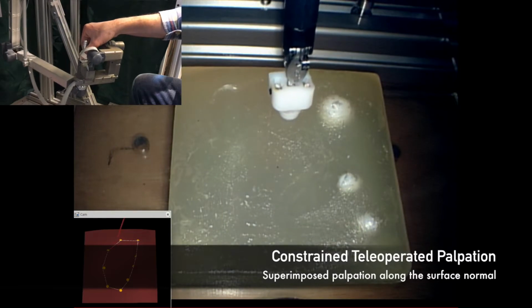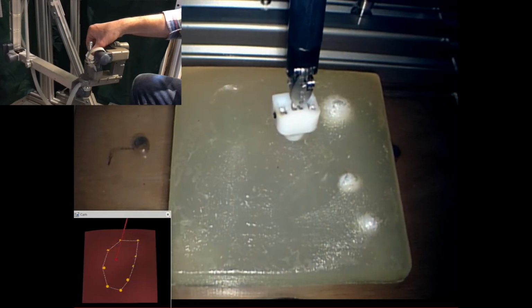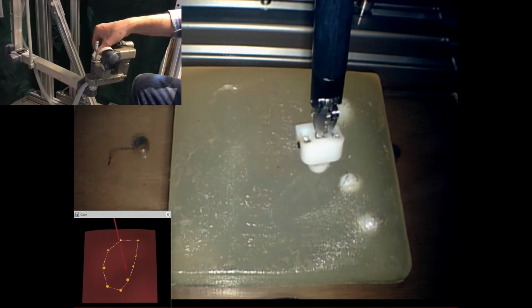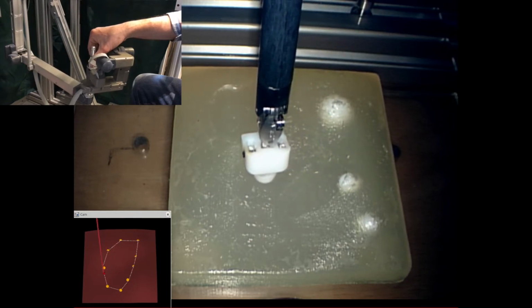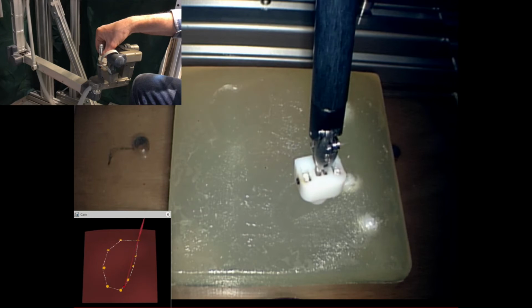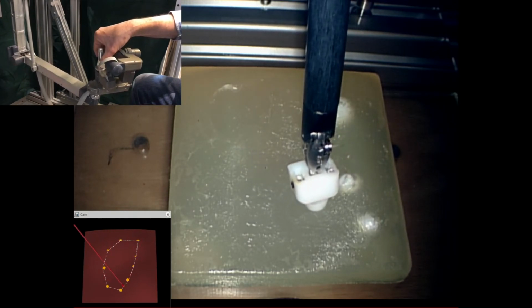Alongside this constraint, we overlay sinusoidal palpation motion to provide semi-automated surface palpation to assist in stiffness and surface geometry mapping. This demonstrates our complementary situational awareness framework using the Da Vinci Research Kit to explore anatomy for intraoperative anatomy registration, model-mediated force feedback, constrained teleoperation, and stiffness estimation.